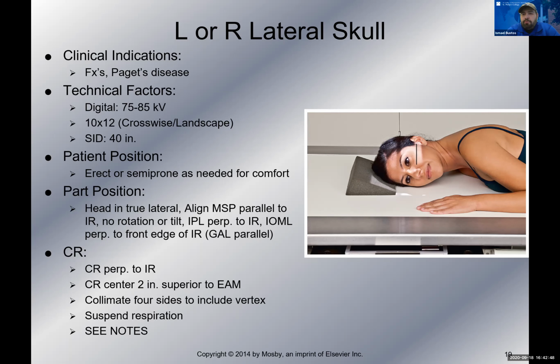Erect or semi-prone, which, well, again, erect is the most preferred, but if you need to do it prone, then you can for patient comfort or if they can't stand. Put the head in a true lateral position. So this is going to be important here, to get this head in a true lateral position. And there are a few positioning lines that we need to look at in order to get that in a true lateral position, all right?